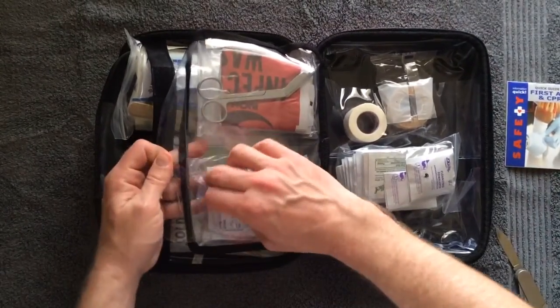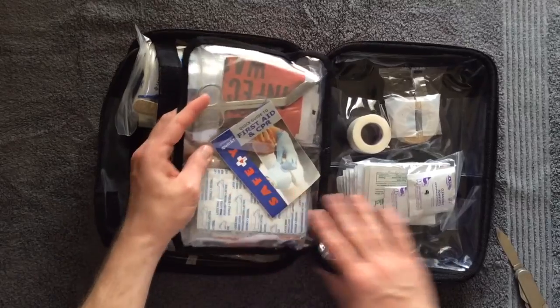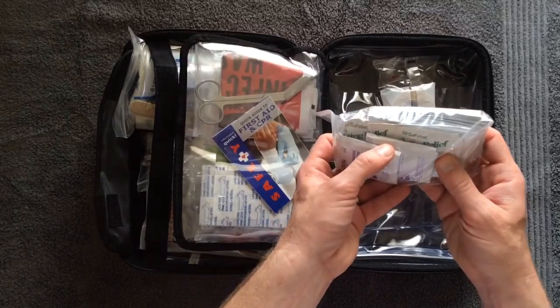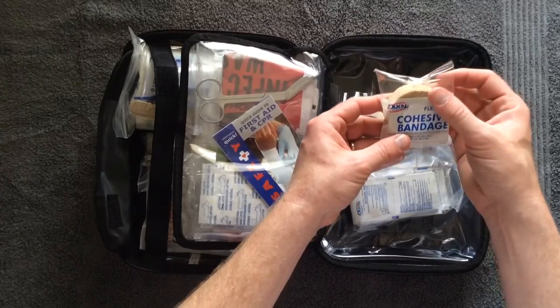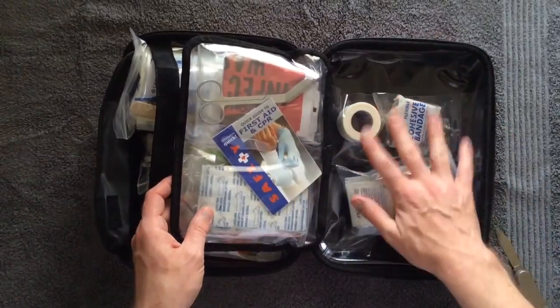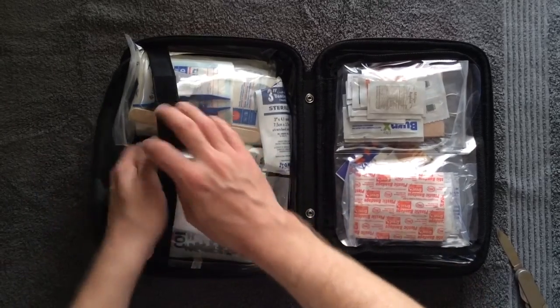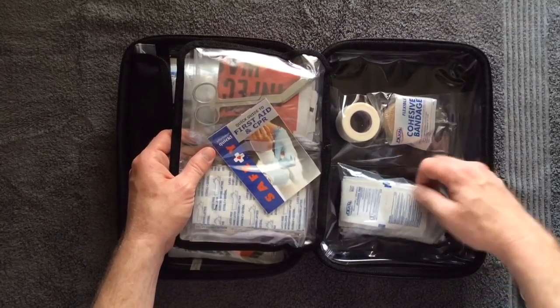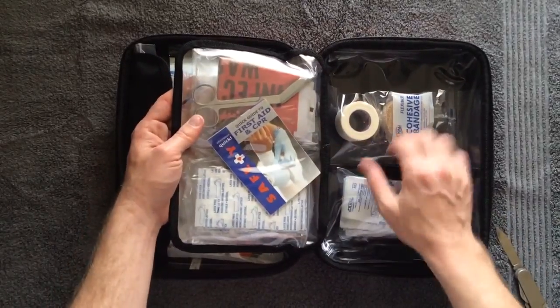Flip that over and there's another compartment — a good place for the first aid guide. There are cleansing towels and lots of cleaning and antiseptic materials, bandages, and tape. Nothing falls out; it's a pretty full kit. There is room though to add more if you want to supplement — more bandages, for example, for those little cuts and bruises when you're out on day trips and picnics. There is room in here for that.